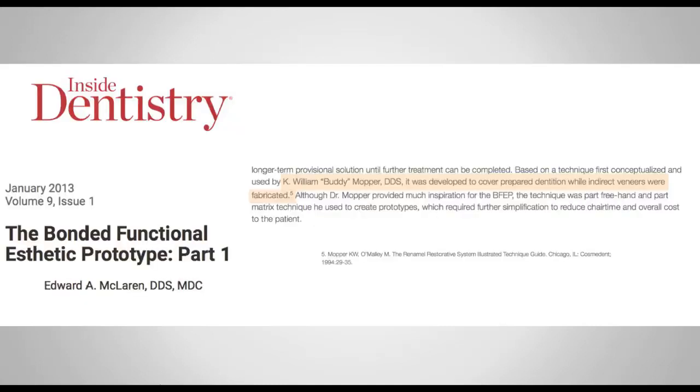Now, is this something new in dentistry? And the answer to that question is no. Even though Dr. McLaren was the one that brought it out to the literature with this new name, bonded functional aesthetic prototype, it really was Dr. Buddy Mopper that introduced this into dentistry many years ago.